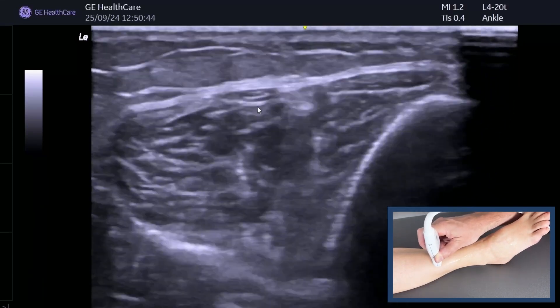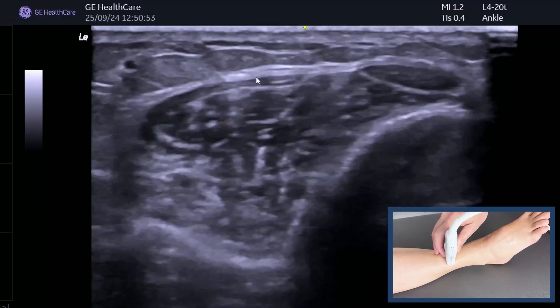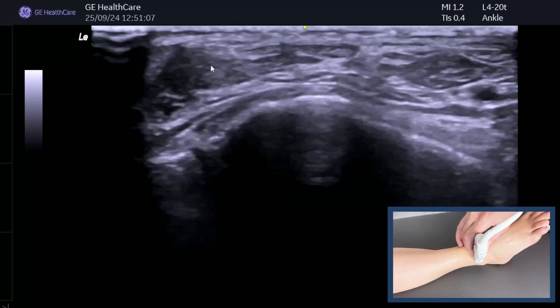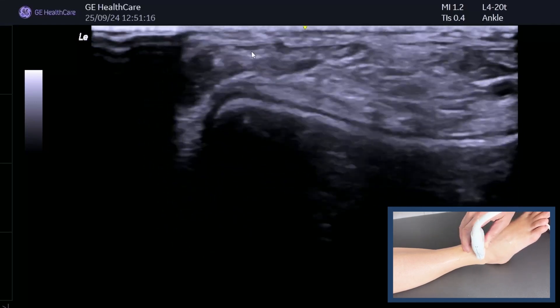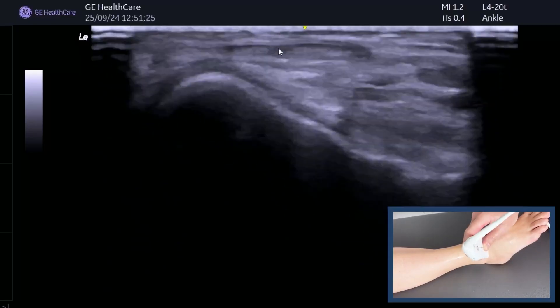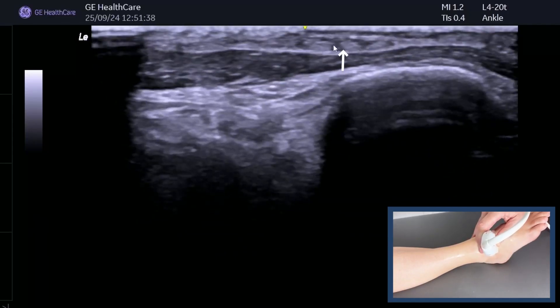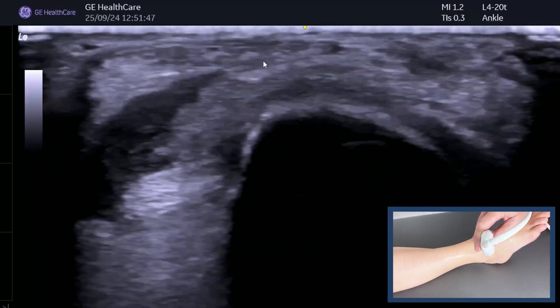Following that tendon up proximally is a really good skill-training exercise. So we've found tibialis anterior, we've found EHL. Now moving more laterally — just above the talar dome the tibia falls away and the talar dome comes up. We know it's the talar dome because it's got articular cartilage. Moving laterally we can see another little muscle belly — this is extensor digitorum longus. Don't guess — prove it, because as we go further down extensor digitorum should split into four tendons. You can see a little bit of fluid coming out of the joint.